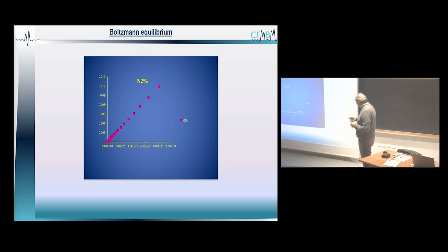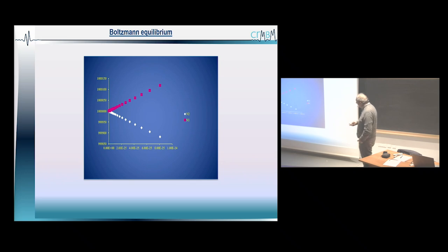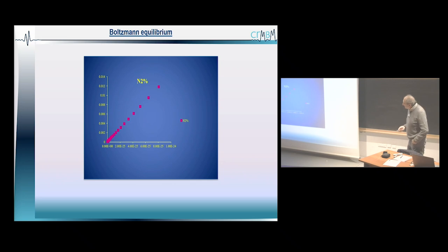And if you go back to this, you can see that if you go higher in the value of magnetic field, the difference is going to be higher, and so the sensitivity of the technique is going to increase. So that's why at 11 Tesla you've got such a resolution, because you are working with more nuclei than you were when using a smaller magnetic field.